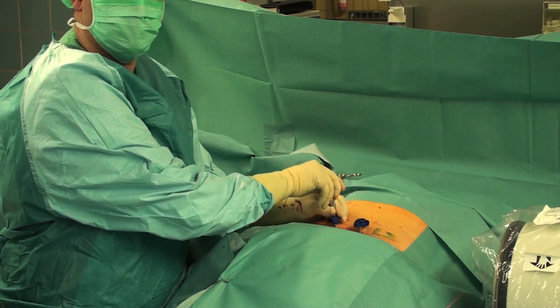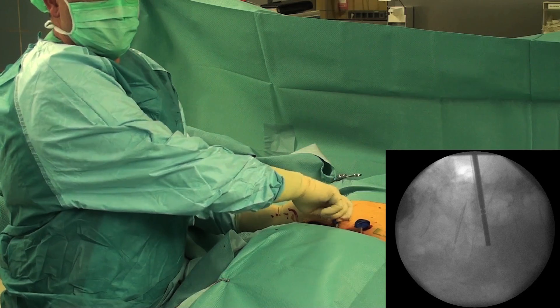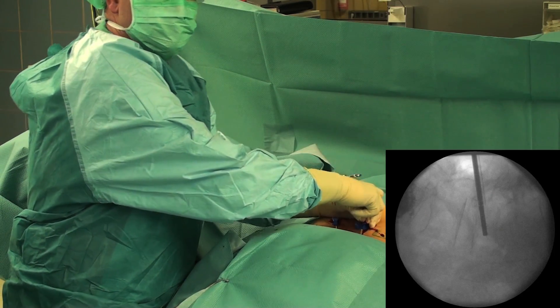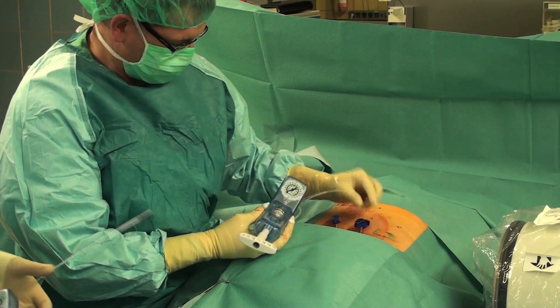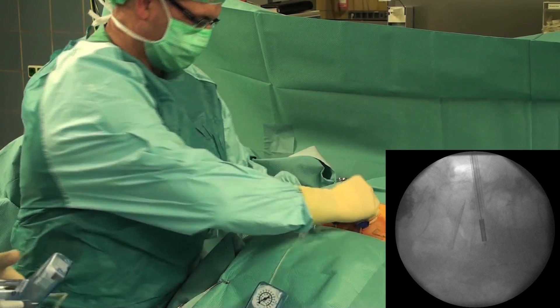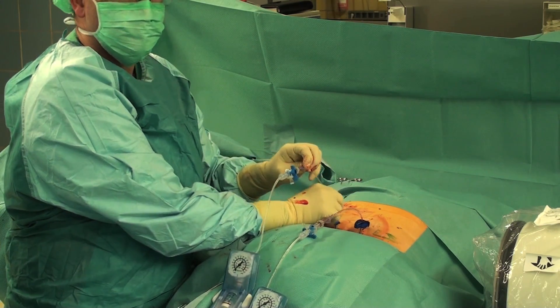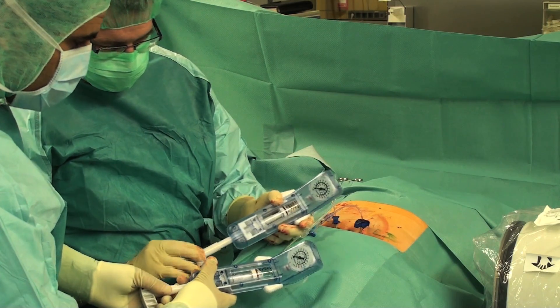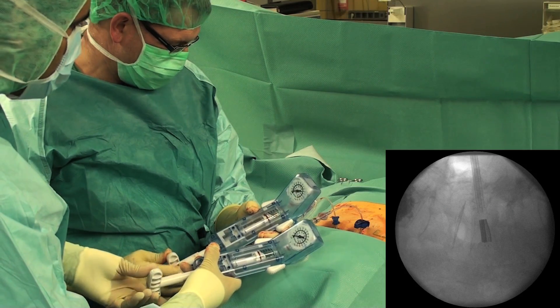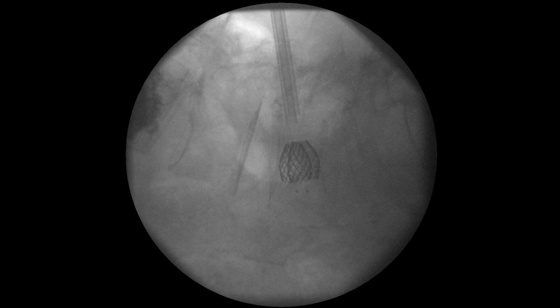Here you can see the situation in the operating theatre. Preparation of the access channel to avoid advancing the instruments beyond the anterior cortical rim of the vertebral body. The vertebral body stents, which are already pre-crimped on the balloon catheters, are inserted and positioned in the medial third of the vertebra, approximately 2–3 mm under the vertebral end plate, in order to lift the affected end plate by inflating the VBS stent. After correct positioning, the balloon catheters are inflated. It is important not to exceed 30 bar pressure, and the height restoration of the fractured vertebra must be monitored under fluoroscopic control in the lateral view.